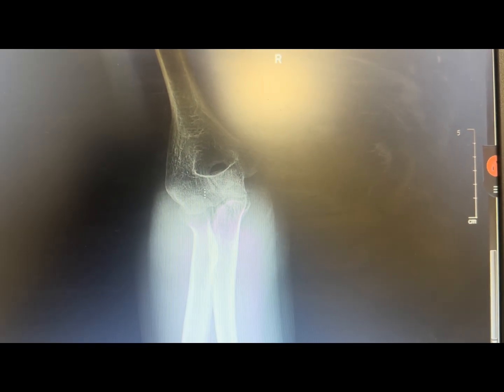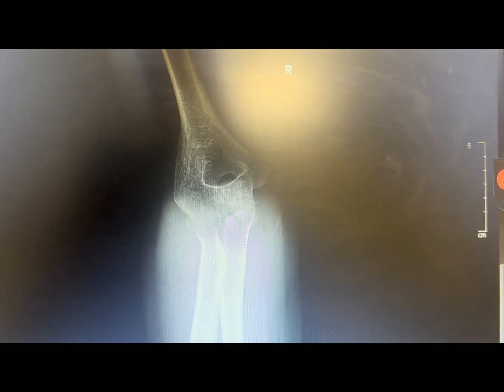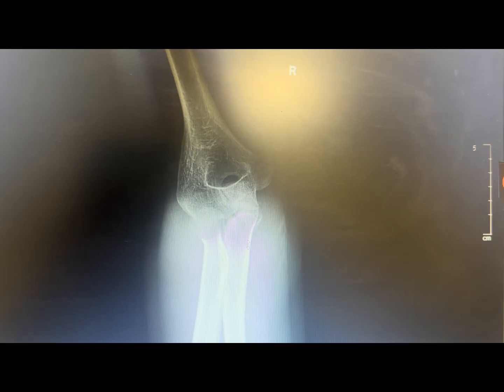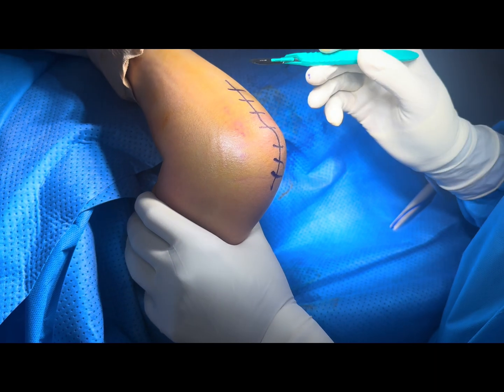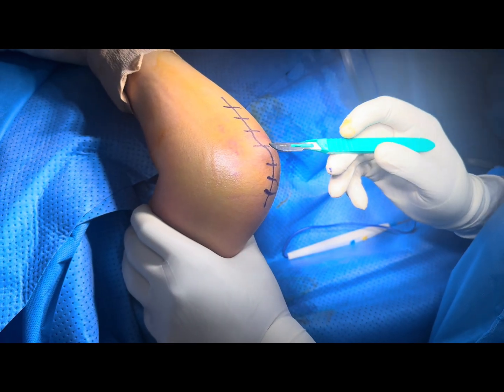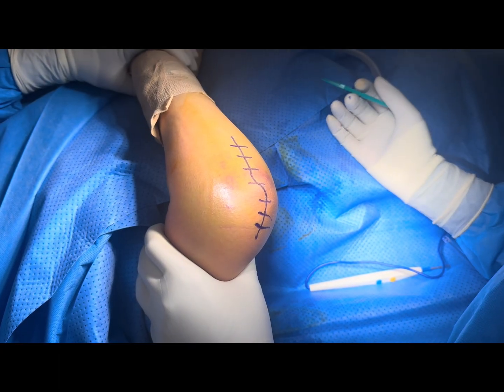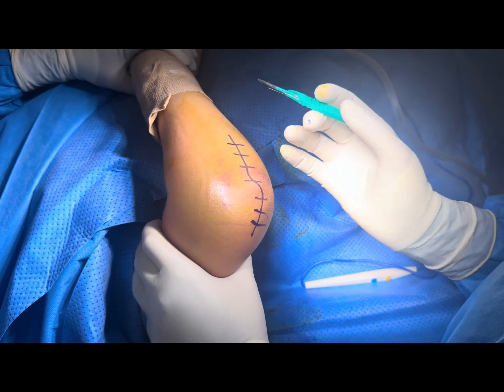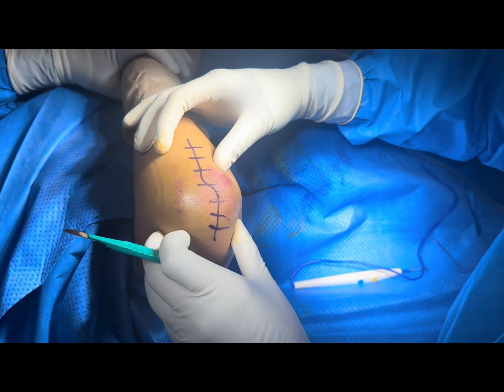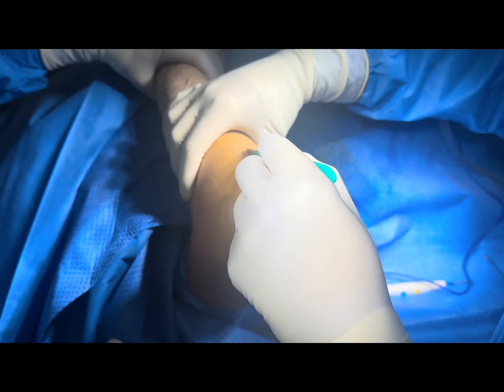Now I will take you through the surgical steps of the tension band wiring of the olecranon. This is the incision mark for the olecranon fracture. I have cut a little bit laterally; the ulnar nerve is on the medial side. We are doing this surgery in the supine position and we have inflated the tourniquet. Generally this surgery is done in the lateral position, but we don't have the attachment for that.